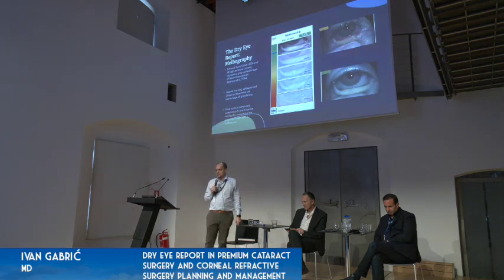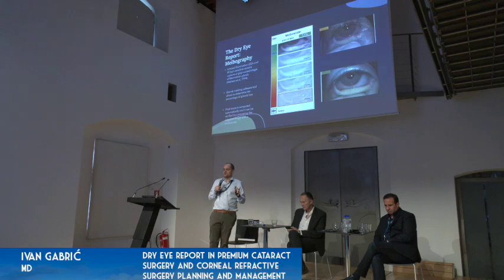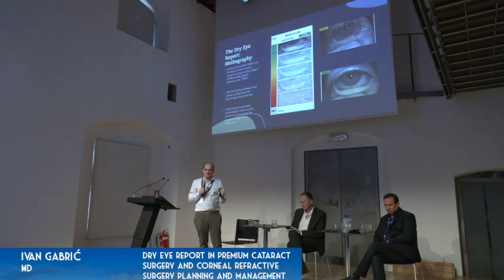And here's the meibography. This tool is amazing, especially if we have, and I see Professor Asaf as well, you have access to a LipiFlow machine. Access to a LipiFlow machine has been vital, especially in the age group of 50 plus, where patients request any sort of high performance, full range IOLs. Having LipiFlow as a way to save yourself before surgery or after surgery is amazing.